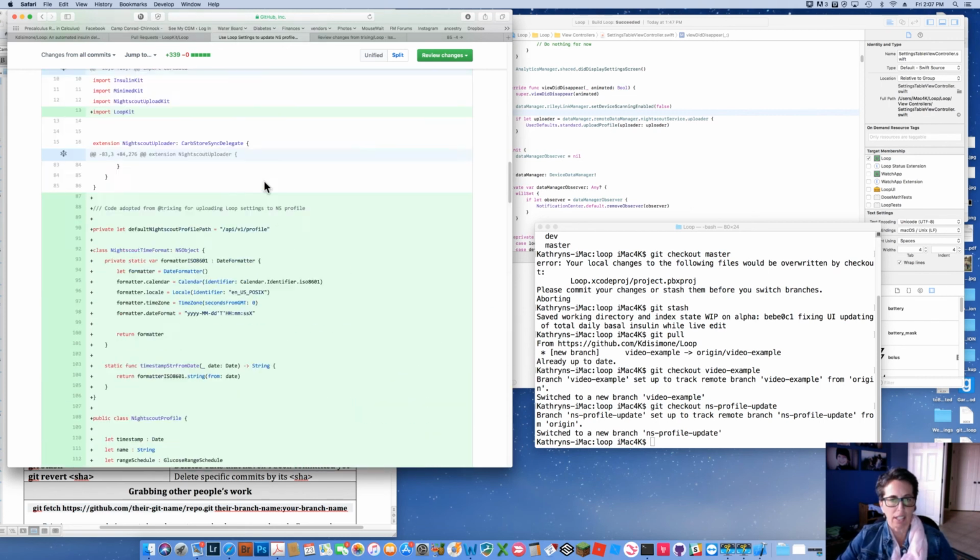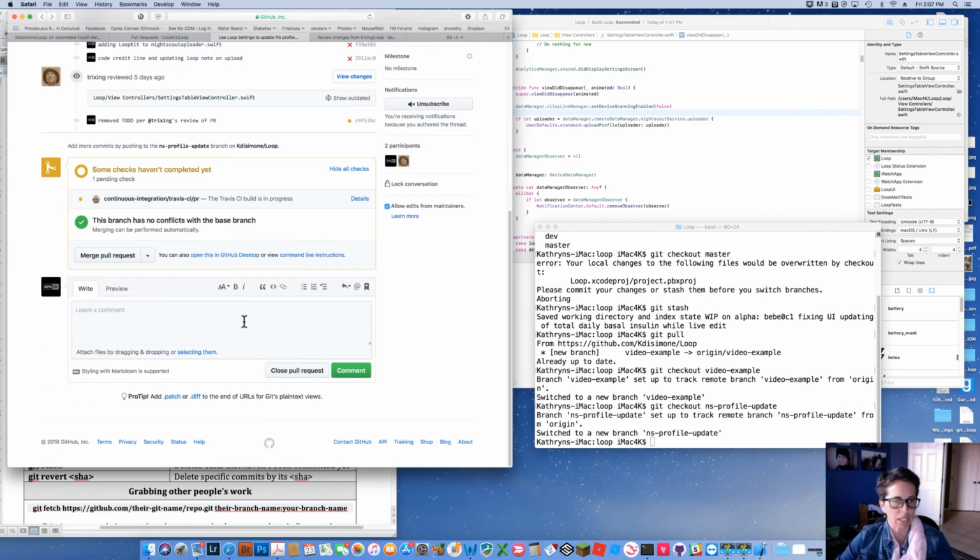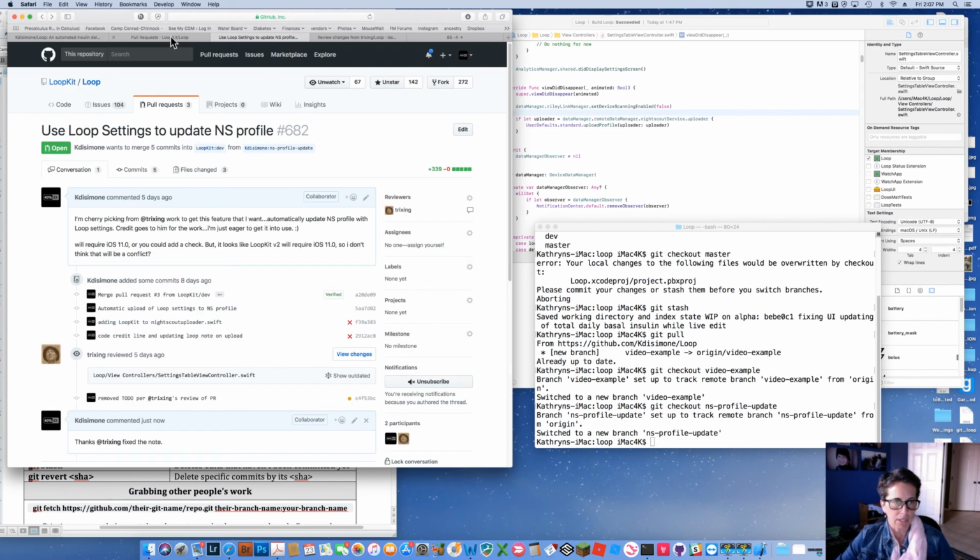It's all done, and I can leave a message back on this conversation and say, thanks, fixed the note. So I can comment and it's there. So that's one of the things you can do. Any PRs that you have on branches that are actively open, any changes you have to those files in that repository will still be there. So while you have a pull request pending, try not to change this branch unintentionally. You keep it clean. That's why people do separate branches.